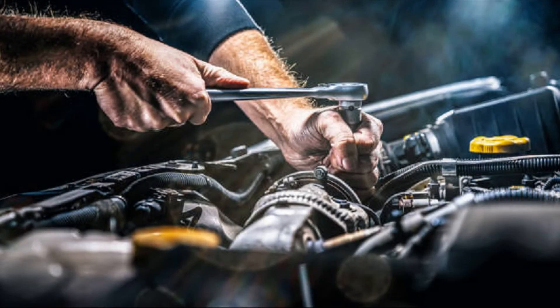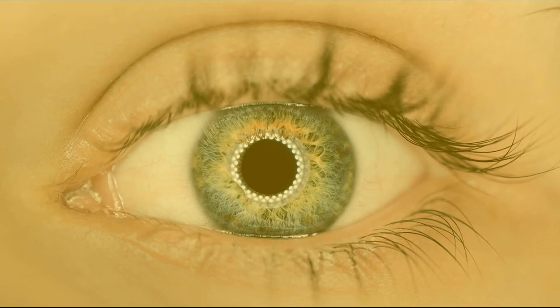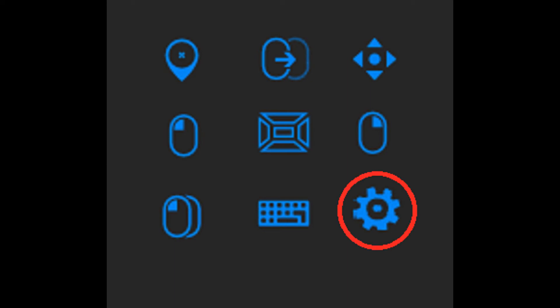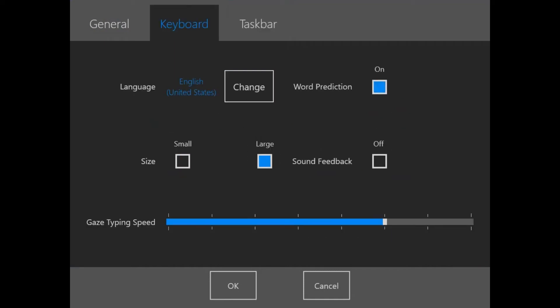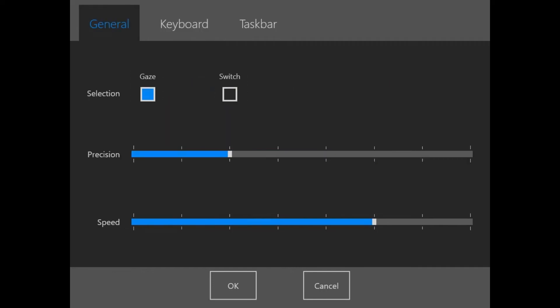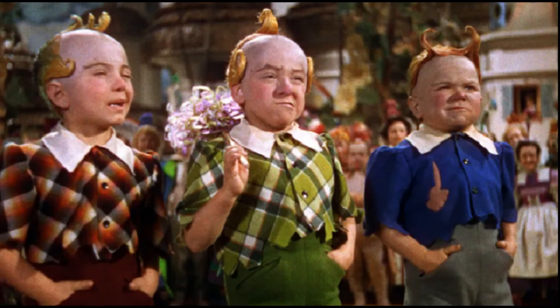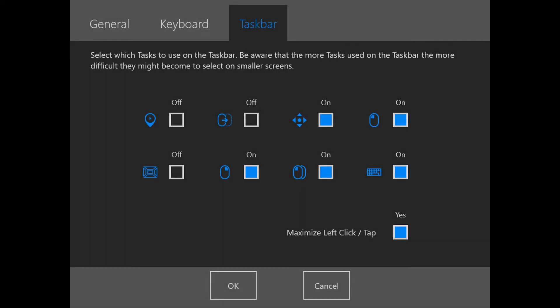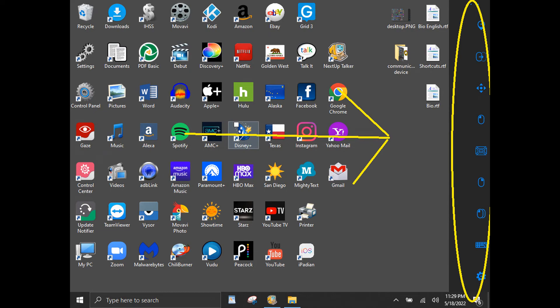I've modified my keyboard to fit my needs. I've switched the space bar and the enter button due to accidental selections using my eyes. I also moved the question mark, comma, and period selections. The little gear icon is for the Windows Control settings — that's where you can add or remove icons on the toolbar, set the speed of the keyboard gaze time, speed of the time to select your target, or select languages. If you have all the icons activated on the toolbar, it's extremely difficult to select an icon due to its reduced size and close proximity to the other icons. I usually keep 4 or 5 icons on the toolbar for ease of use, and it also depends on which task I'm trying to do.